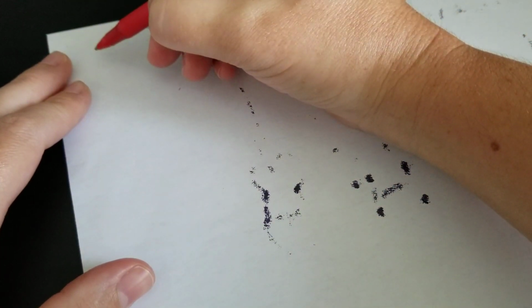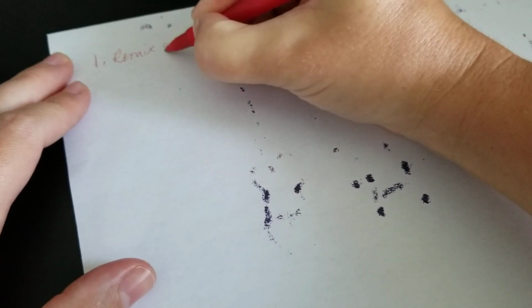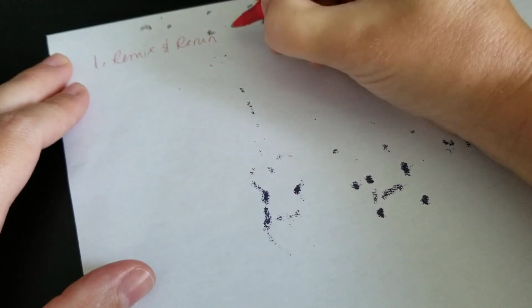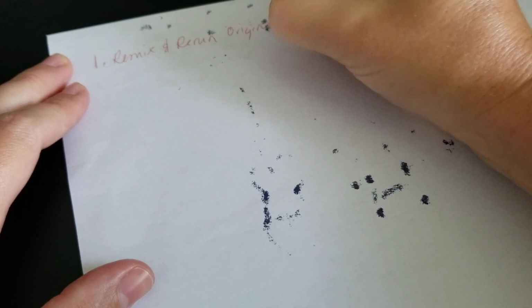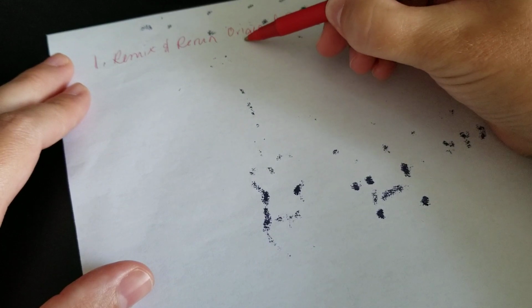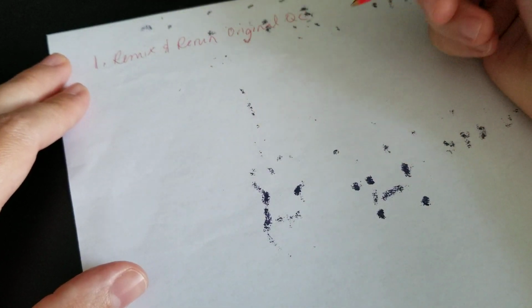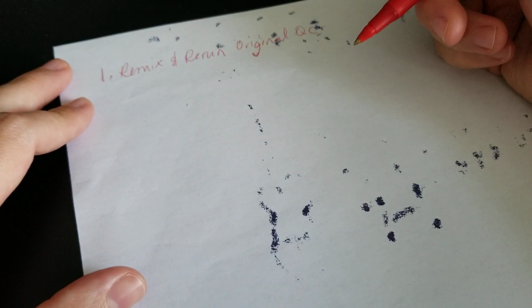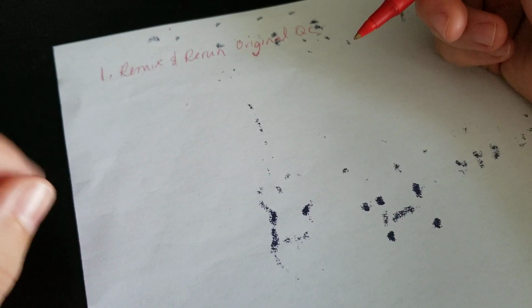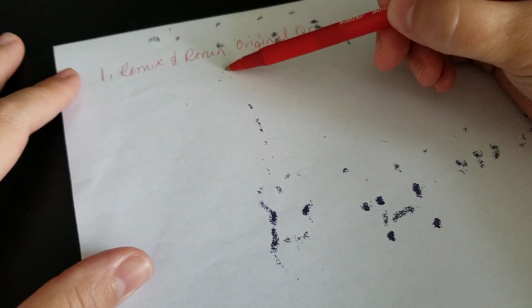But the first thing you always do is remix and rerun the original QC. And the reason for that is because it could just be that the QC is getting old. It's down at the lower end of the bottle at this point. It's concentrating because it's been used so much. You don't know, so you're going to check that. All right, so that's the first thing you do.